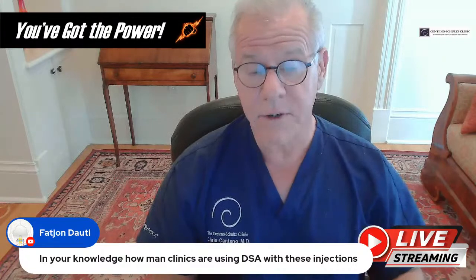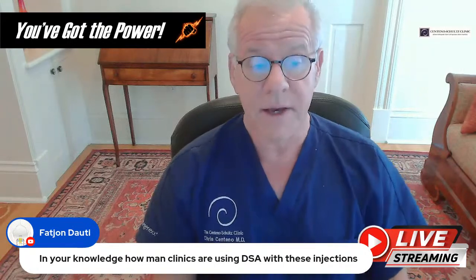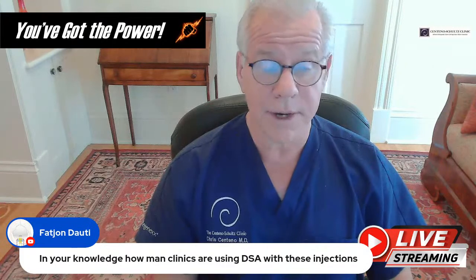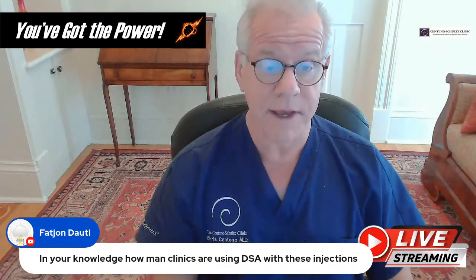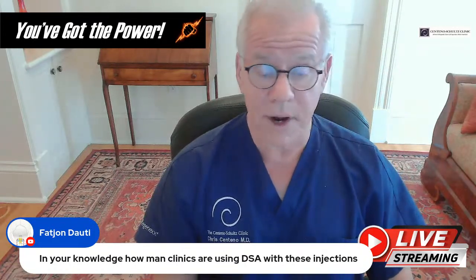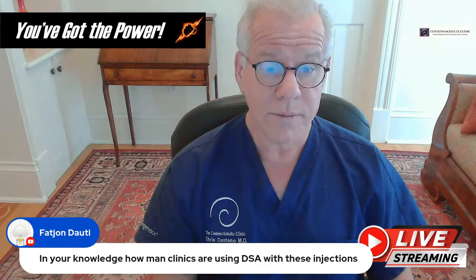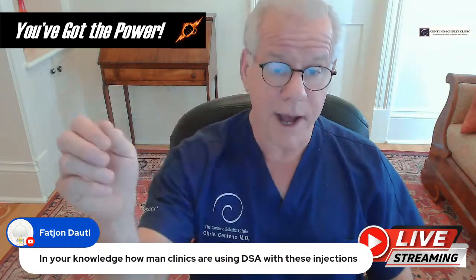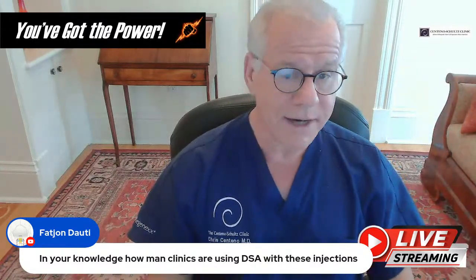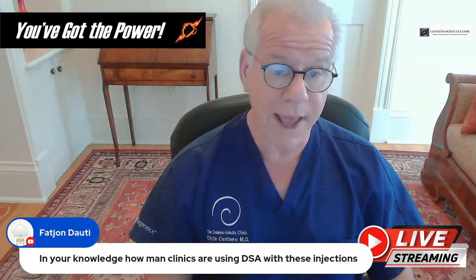But then if we get into interventional spine clinics that actually can do these injections and do use fluoroscopy with contrast, about 90% of those are not going to have digital subtraction angiography because it's a vascular package and it costs money. It's about a $20,000 upgrade on a $120,000 C-arm. So most clinics won't have checked that box because why do they need it, right? They don't inject this area. So there's no reason to spend that 20 grand if you don't have to. So the vast majority don't even have it.